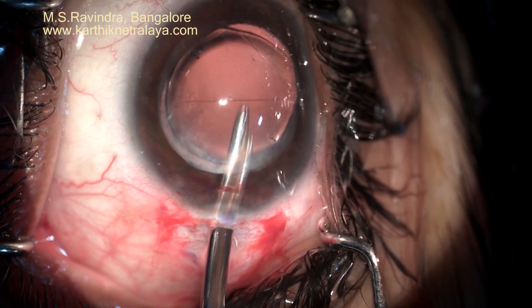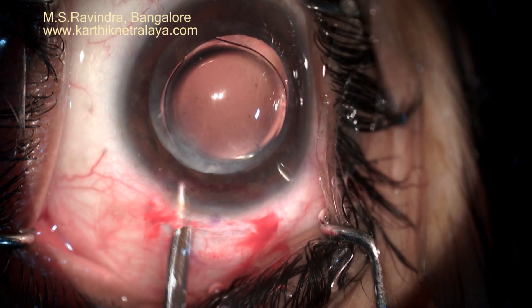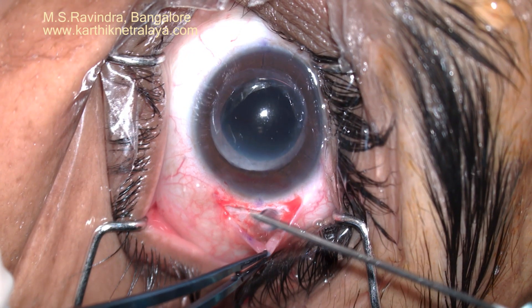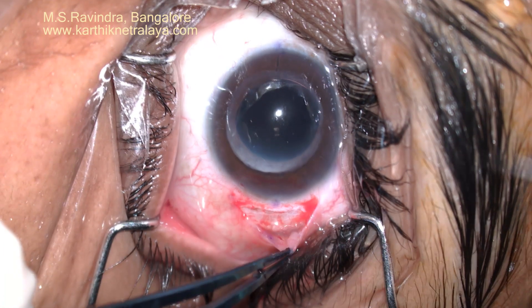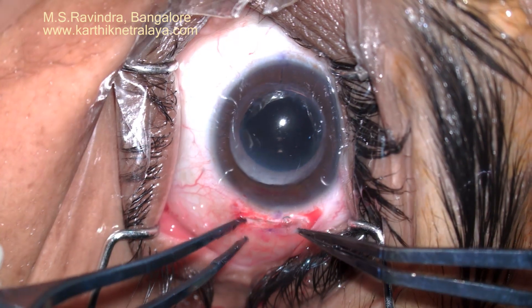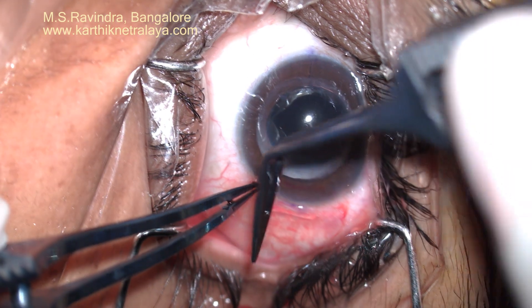It is important to remove every bit of viscoelastic from the anterior chamber, from the capsular bag, and from behind the lens. The eye is pressurized to normal intraocular levels. The tunnel is self-sealing. The eye is kept without sutures, done under topical anesthesia.